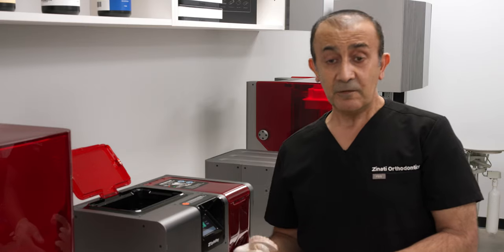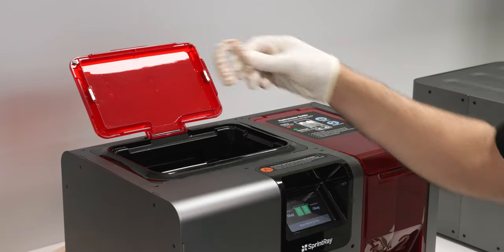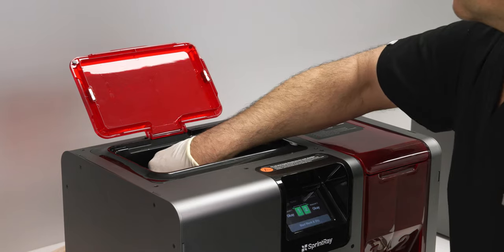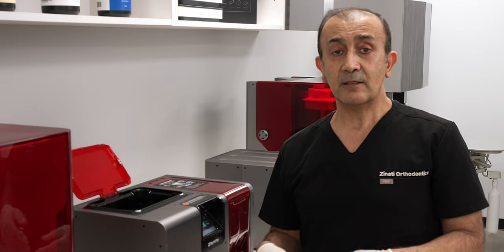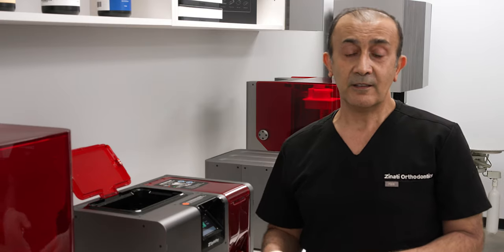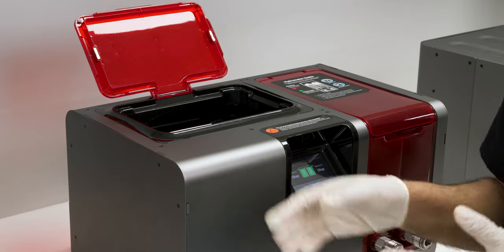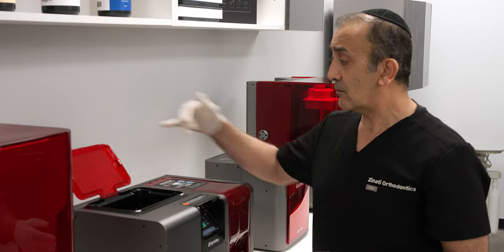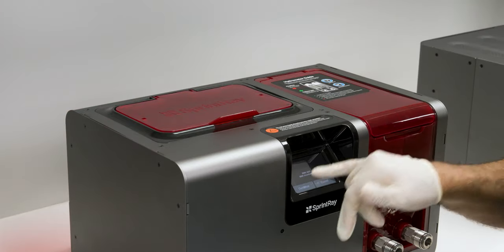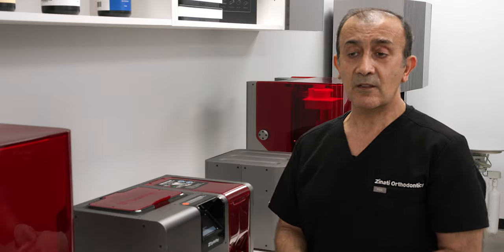This next part is actually my favorite — putting the model in the Pro Wash. Before this we used to use two different alcohol baths, shaking the models in there, and it was a messy process. This is so convenient because the cycle is about 10 minutes. You just put the model in, close the door, start the wash, and come back in about 10 minutes and everything is done.